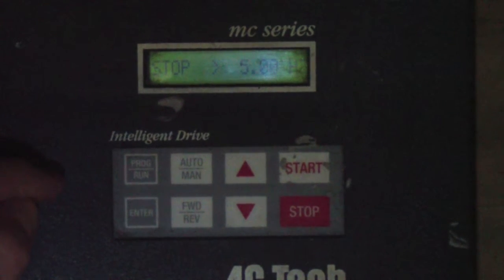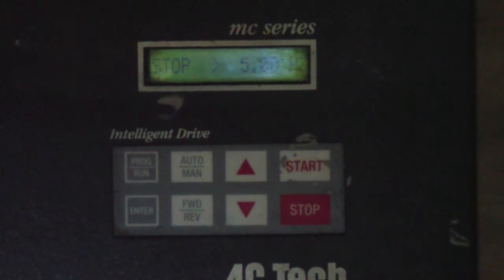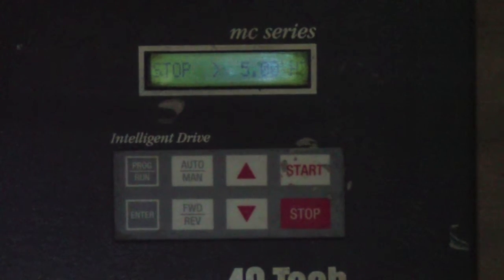You're now back at your stop screen, but the one difference is between the P in the word Stop and the 5, you'll see a little right-arrow. In order to complete the procedure, one more thing has to be done: the power cable from your Swimometer that plugs in on the left side of the AC-TEC. You're going to want to disconnect this cable, wait about 10 to 15 seconds, and then reconnect it. That will reestablish communications and reset the Swimometer.